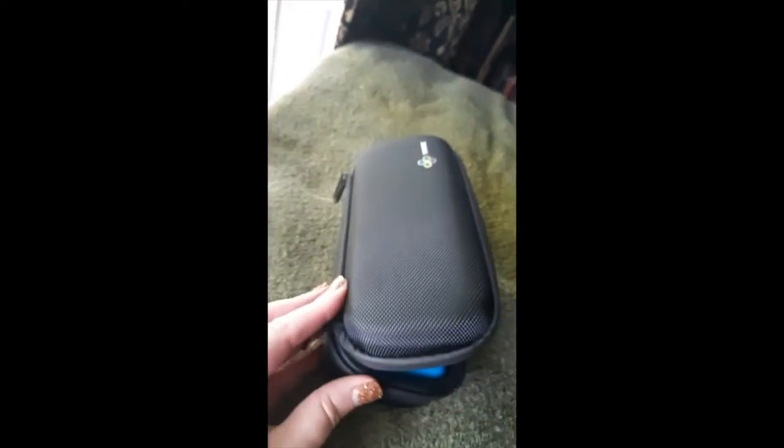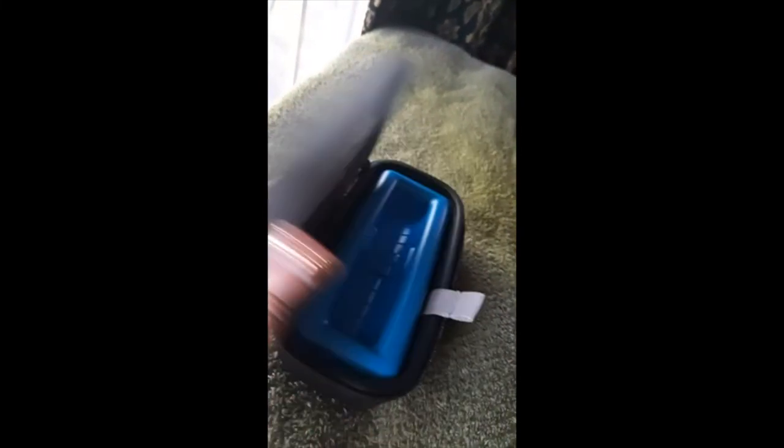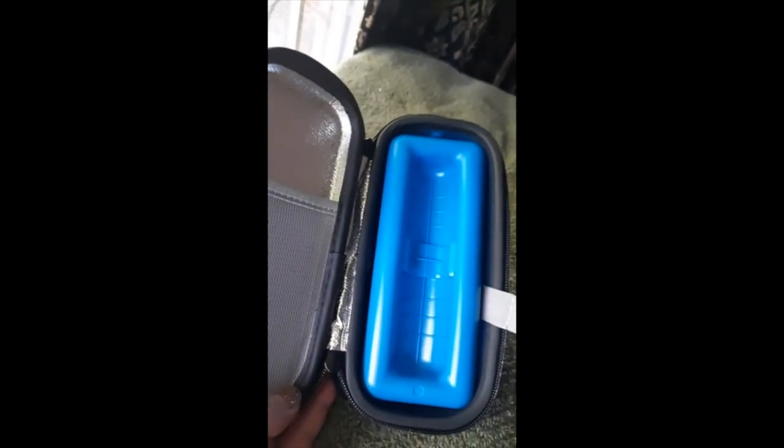Really well made, really sturdy. The only issue at all is the zipper's a little bit herky-jerky. That could be a little hard if someone has arthritis, but they're probably going to have somebody with them who's going to help. And it'll probably smooth out over time, but other than that, really nice, really sturdy case, really smart idea.